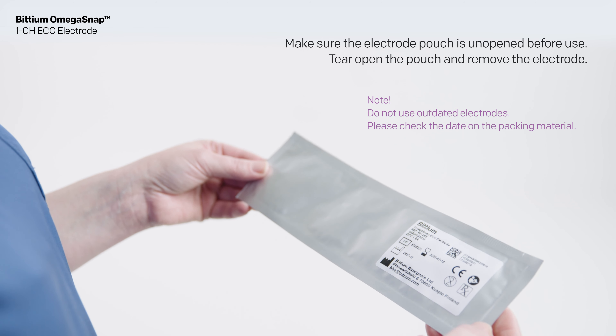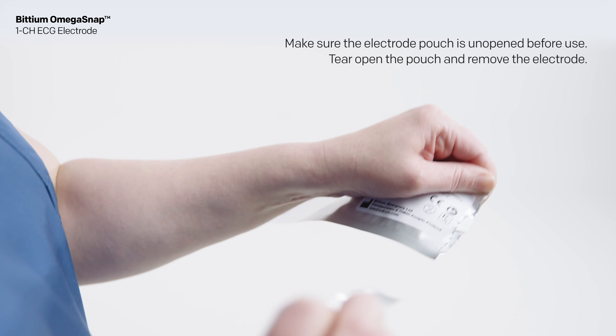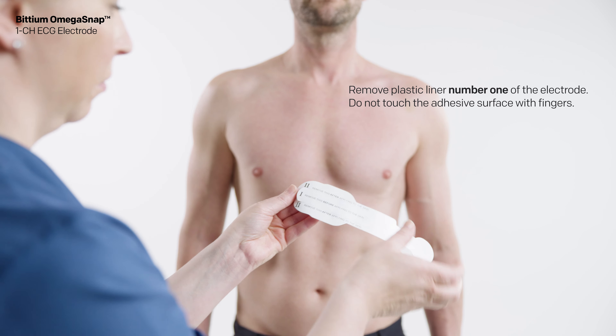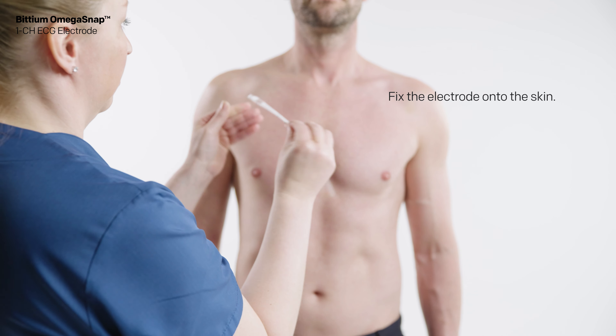Make sure the electrode pouch is unopened before use. Tear open the pouch and remove the electrode. Remove plastic liner number one of the electrode. Do not touch the adhesive surface with fingers.